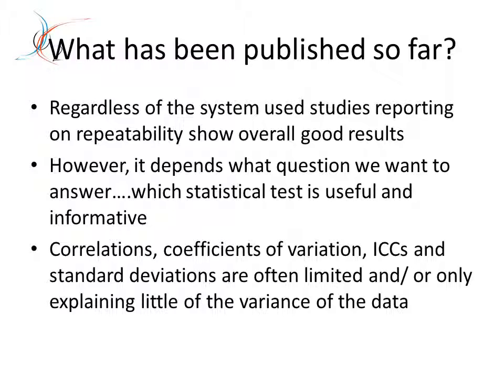What do we want to know? Do we want to know the extent of the difference between the two? Do we want to know the extent of the difference, how it varies across the different values that we can measure, so across the whole range of saturation values, for example?